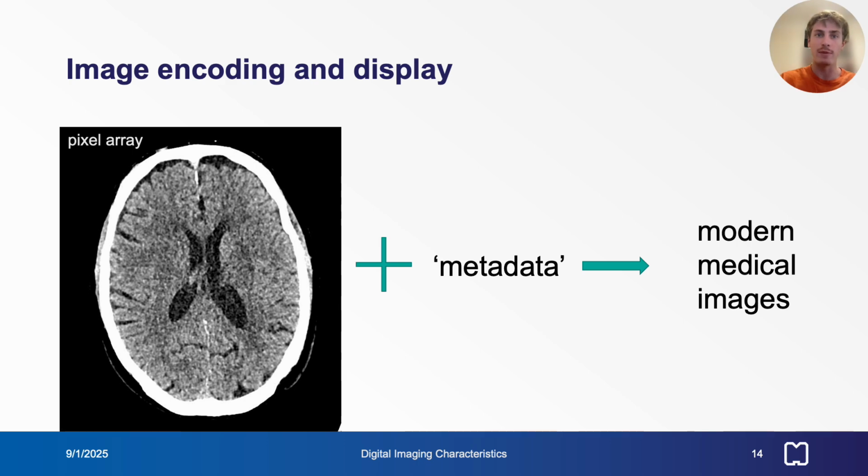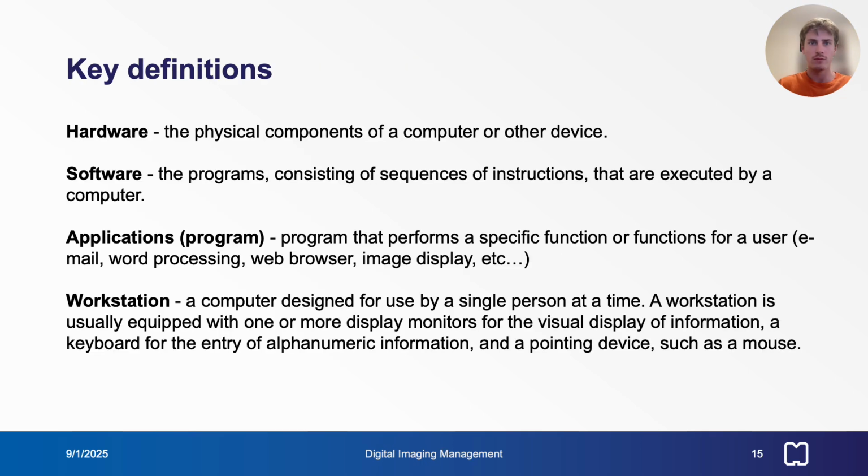These metadata may be stored separately from the pixel data, or more commonly, in a header preceding the pixel data. Together, these constitute a medical image.